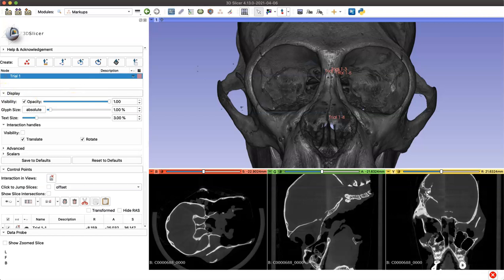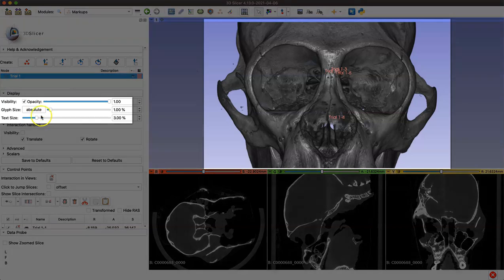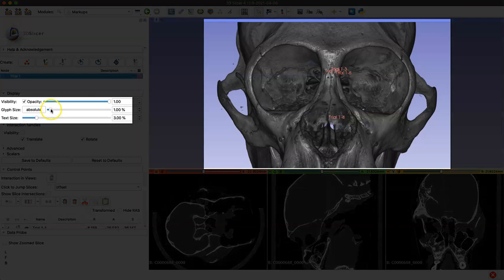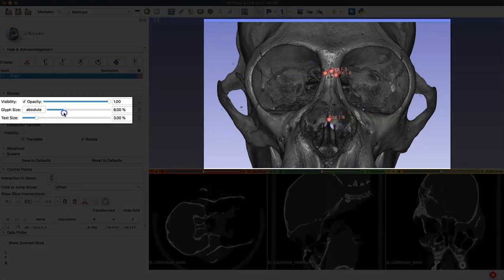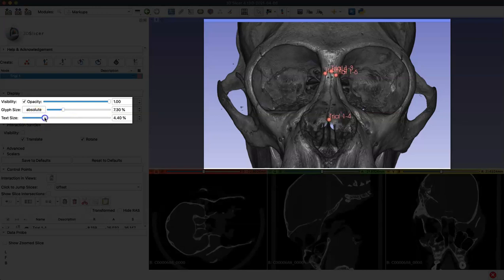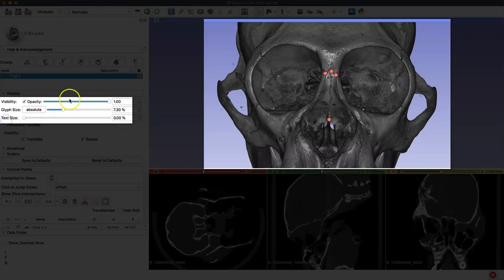Now open the display drop down menu. Here we have a bunch of options for adjusting the settings of our fiducial points. One of these settings is the glyph size, which changes the size of your fiducial point on your model. Watch the model as I move this bar. You can see those fiducial points getting larger and then smaller. You can also adjust the text size and change the opacity of the points themselves.